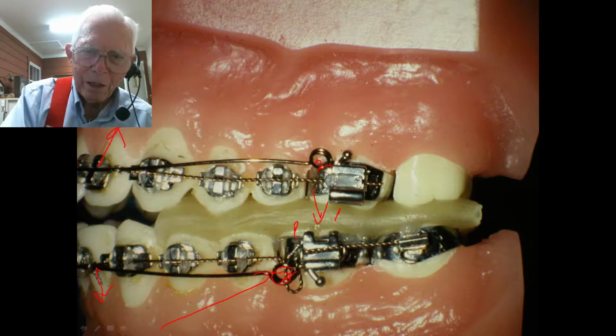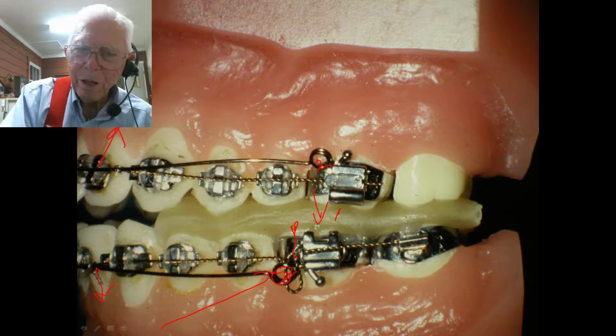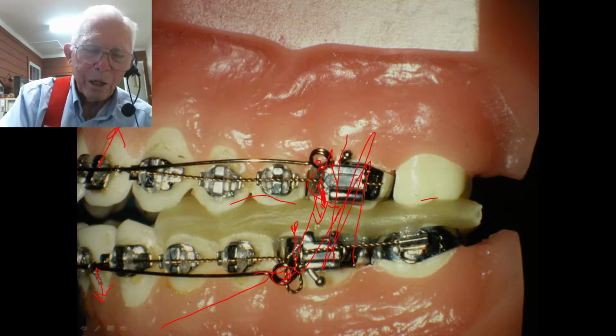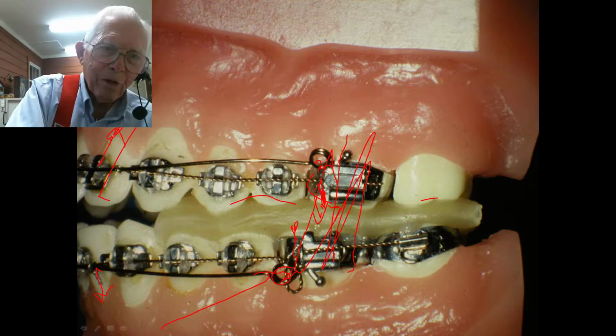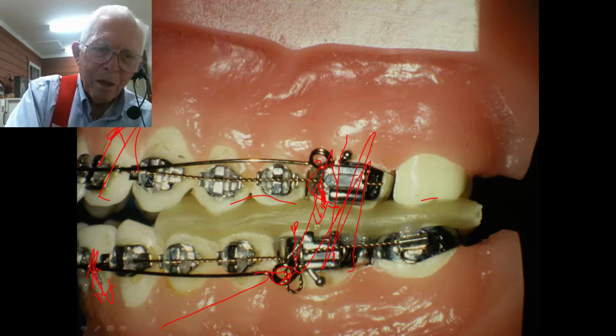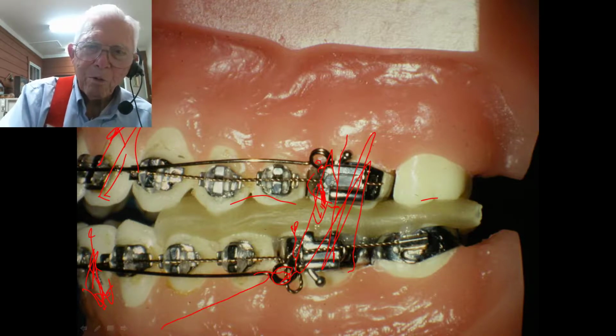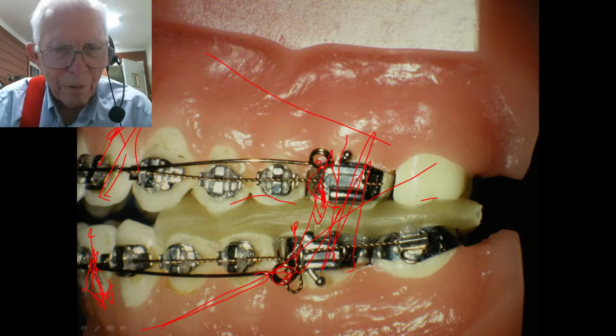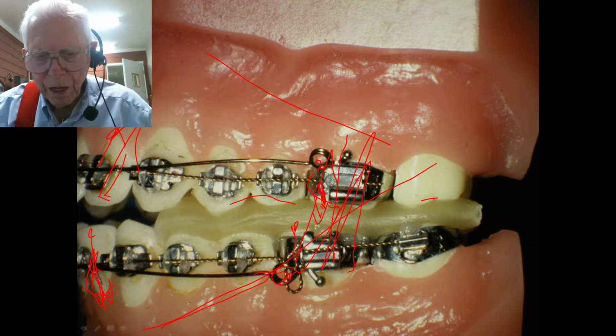Now this one can't rise up. You see, if you start to raise this, it will try to rise, but it can't do it. This one will go down a little bit, but then these don't touch when it goes down, so when they bite on it, it closes this up. And so you can keep these teeth almost exactly as they were while you elevate the upper teeth and bring the lower teeth down, and you won't open the vertical of this person's face one bit. Sometimes you close it in doing that.